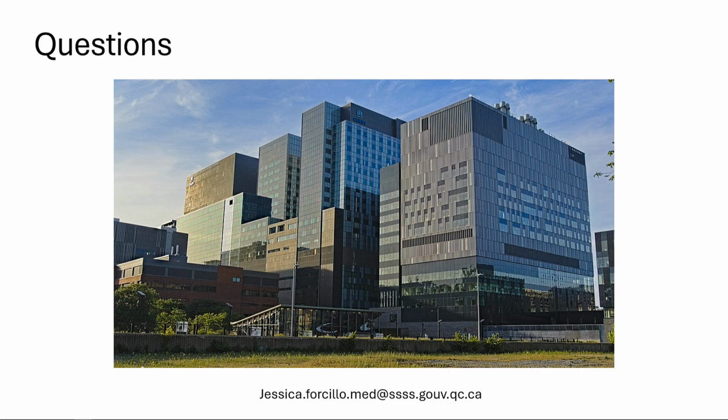I think it's both. And also, I mainly think about lifetime management as well. Should this patient have 1 procedure or 2 procedures? What is acceptable for this patient in terms of that? Because repeat surgery, TAVR explant, has surgical mortality and morbidities. Now we learn we're better at explanting those valves and the mortality is less because we learn. This is the experience. But definitely for a patient, that's the type of discussion that we have during the heart team, and it's really challenging.